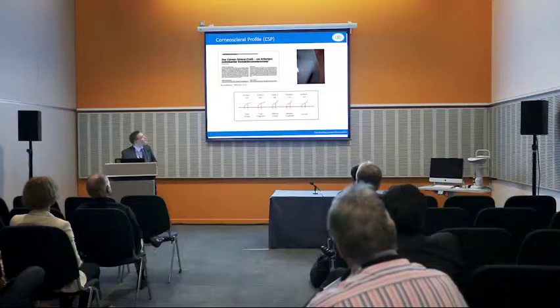He took measurements of eyes using impressions, and from those impressions, he painstakingly measured the curvature of the eye. Now, in actual fact, he only measured the scleral curvature. He didn't take into account the actual transition between the cornea and the sclera. A very good piece of work in its day, painstakingly done, but certainly with some limitations.